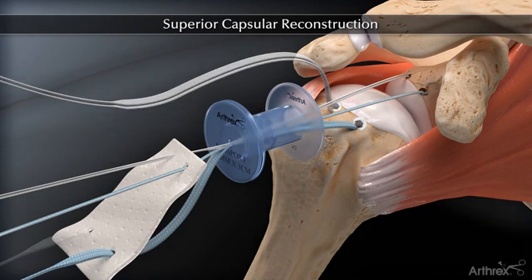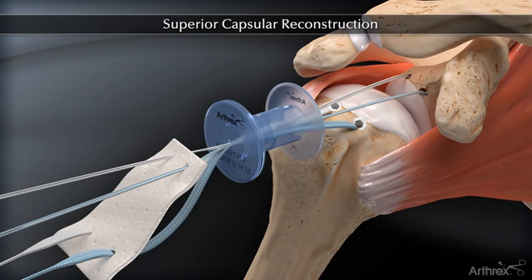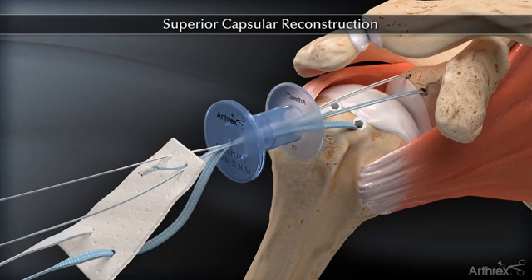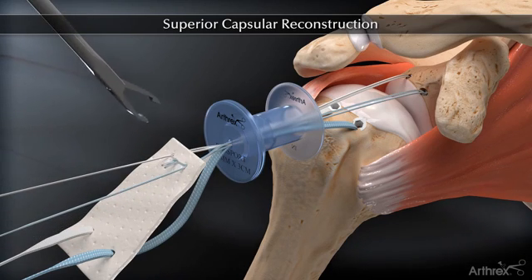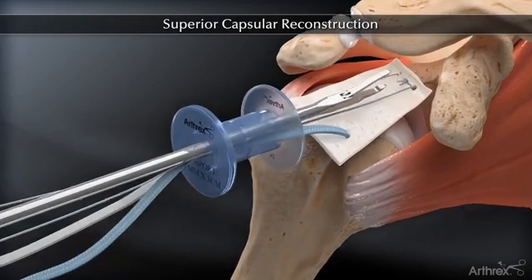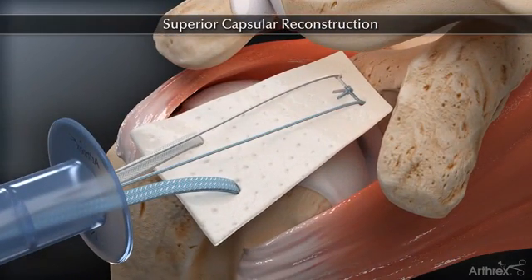The medial glenoid anchors and sutures are used as a pulley to help position the graft into place. One of the suture strands from each anchor are tied together over the graft. A Kingfisher tissue grasper is used to advance the graft through the passport cannula and into the glenohumeral space.